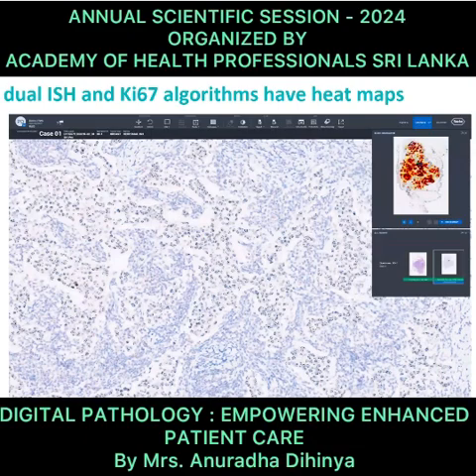Now, if you look at the heat map available in the right-hand corner, you can see various colors here. You can see the yellow color, the orange color, and the maroonish color. The maroonish color makes it very easy for the pathologist: okay, this is my highly amplified area. Orange becomes your moderately amplified area, and yellow becomes your low amplified area. So in a frank tumor, it becomes very easy for the pathologist to report it out.